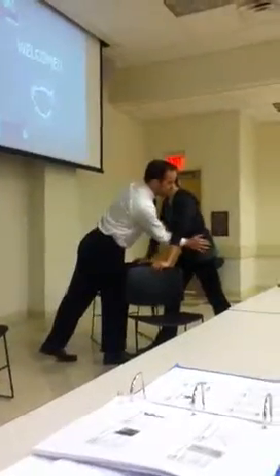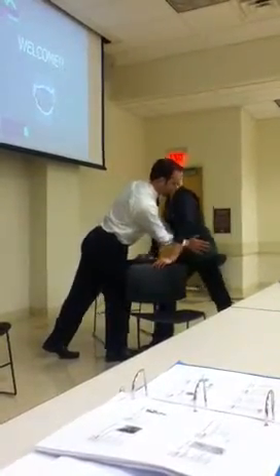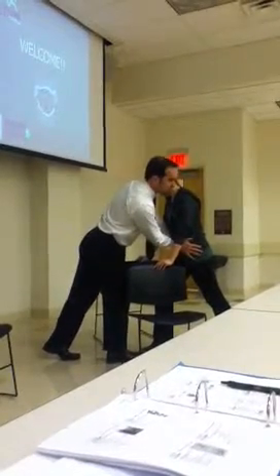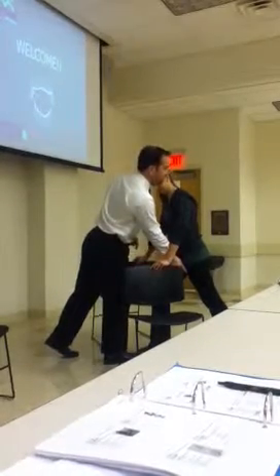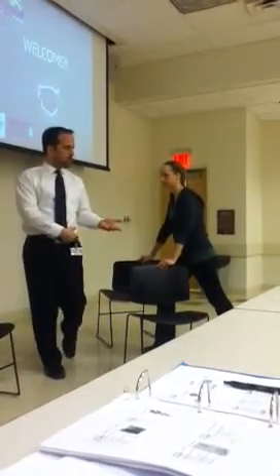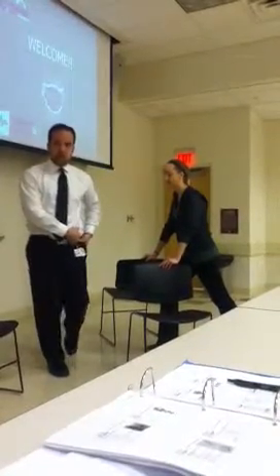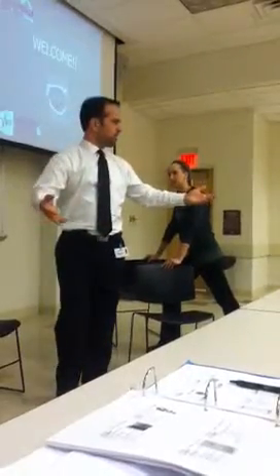All you need to do is just go ahead and push into my hand. Push into my hand. Now stop — do that one more time. Push. Stop. Right there. I said push into my hand with her hip. Are the right knees starting to bend? Are the left knees starting to bend? I didn't tell her to do any of that, but that's what's happening naturally as a response to firing the pelvic muscle. My knee's starting to bend here as I'm loading. This knee's starting to bend as I'm about to release it, and if we were to keep going, she would just take her step and keep right on going.